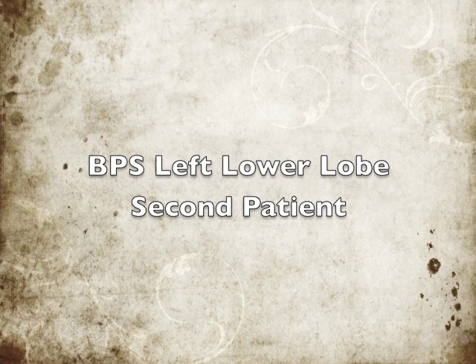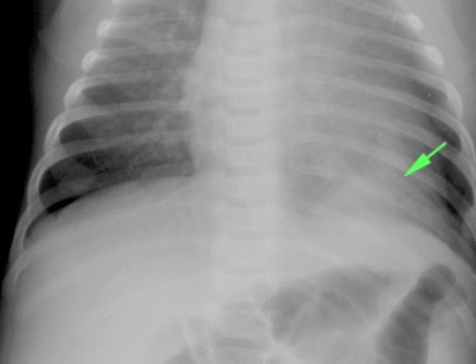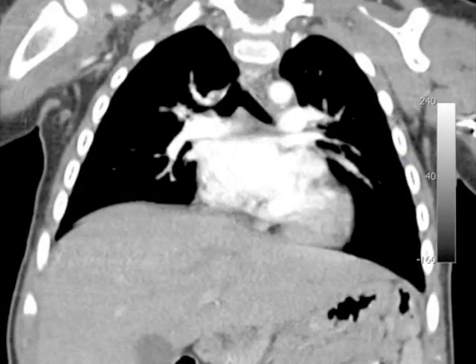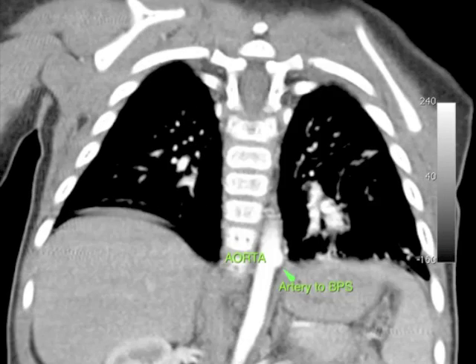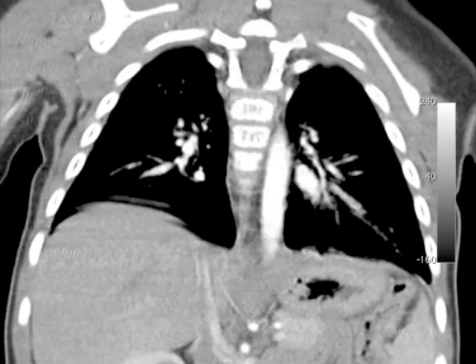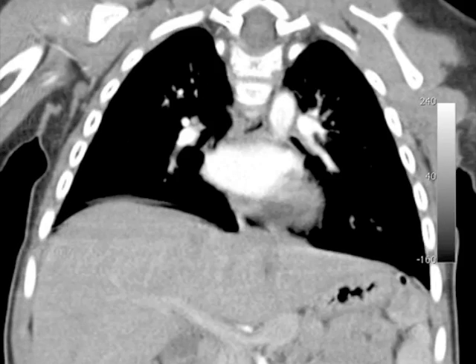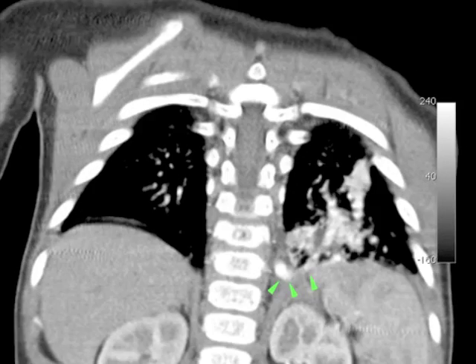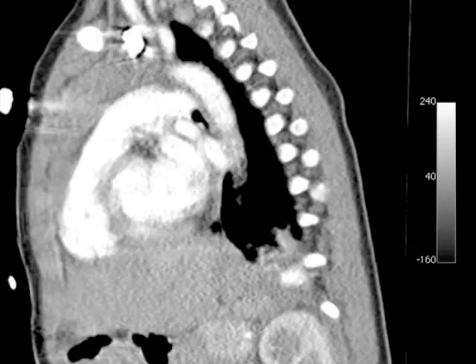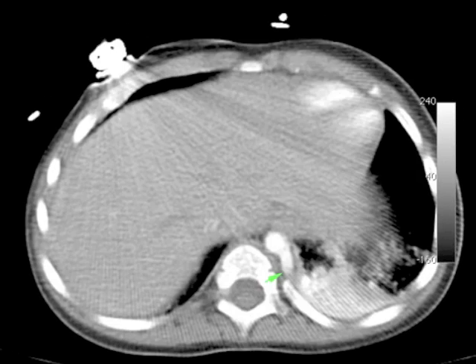The second case is of a young boy who began having recurrent pneumonias at five months of age. On chest radiograph, this patient had a persistent opacity in his left lower lobe. The patient eventually had a chest CT for further evaluation. In the coronal plane, you can clearly see the anomalous artery arising from the aorta and coursing towards this segment of abnormal lung. This was where the consolidation was appearing in the left lower lobe. Note how the segment of lung enhances, which is not what you expect to see on a typical pneumonia. These findings are also nicely visualized on the sagittal series. On the coronal and sagittal series alone, we can make the diagnosis of pulmonary sequestration, having seen the segment of abnormal lung and its anomalous arterial supply.